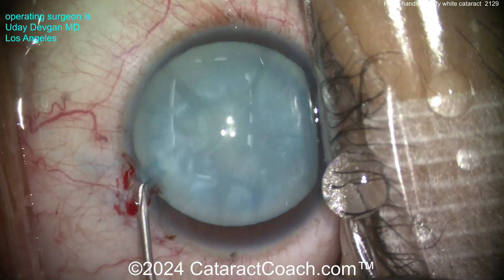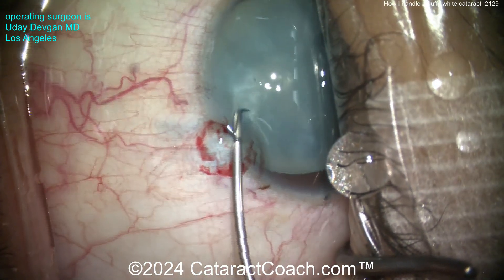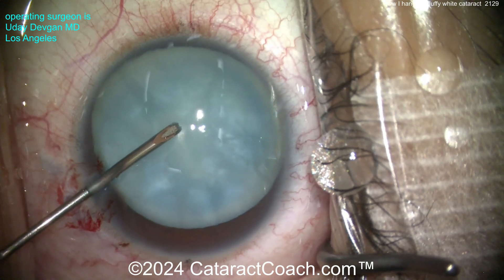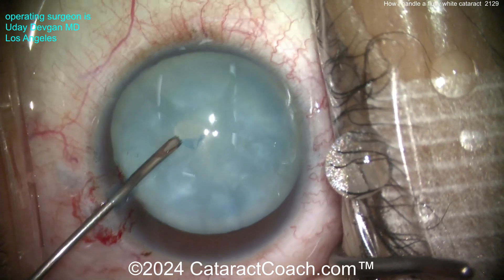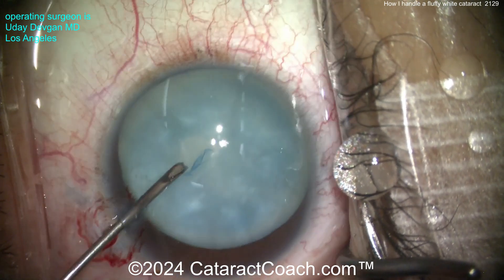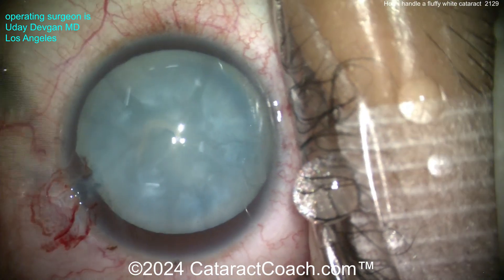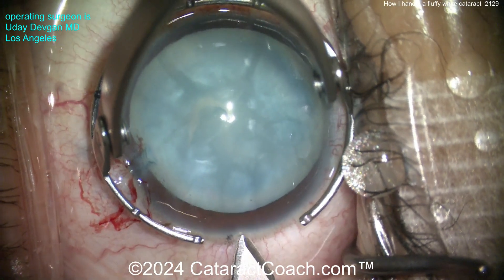We're going to go in now with the cistotome. Notice there's no main incision yet — I've got the AC pressure relatively high to keep that anterior lens capsule flat. Going with the cistotome through the side port and poking in the middle. It opens up — not a lot of lens milk. There's really not a lot to decompress in this eye; there's no liquefied lens material. This is not an intumescent or fluid-filled cataract. It's white, but all the lens material here is fluffy and soft, not yet liquefied.